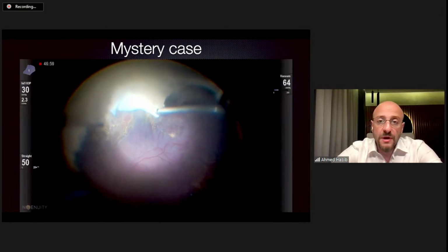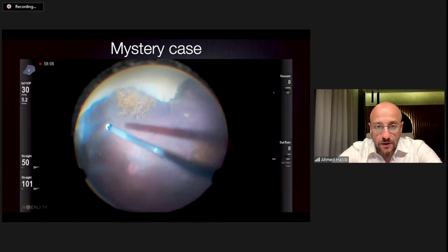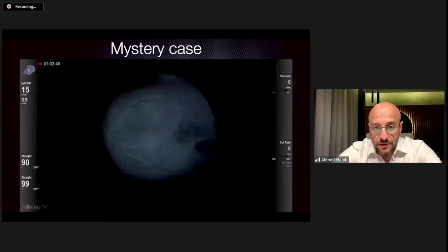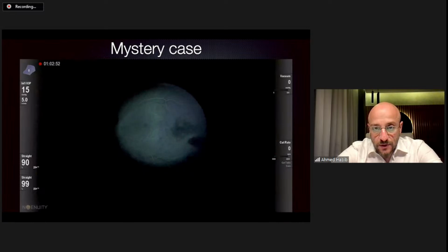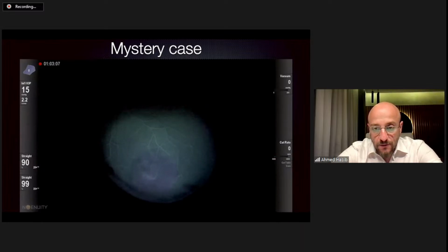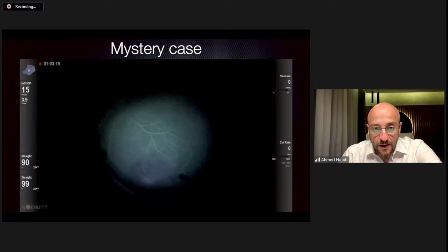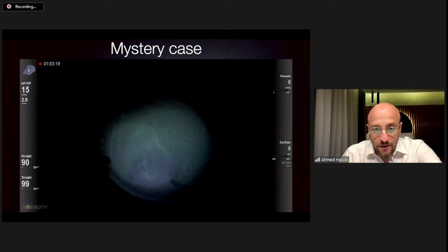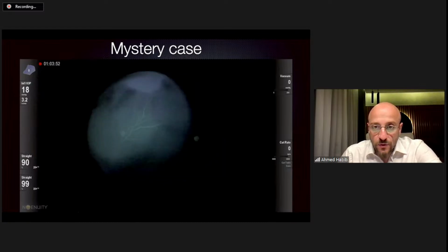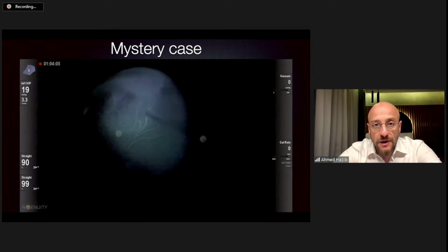We were thinking that's a very early case of Coats disease, but when using the intraoperative fluorescein and seeing the actual picture, we were thinking about other options. So that's my newest filter, and as you can see, there are some areas of capillary non-perfusion, and there is an arteriovenous anastomosis. Here I'm going through the veins and the arteries to see if it is actually an arteriovenous anastomosis, and also an area of capillary non-perfusion and some microaneurysms and vascular abnormalities.